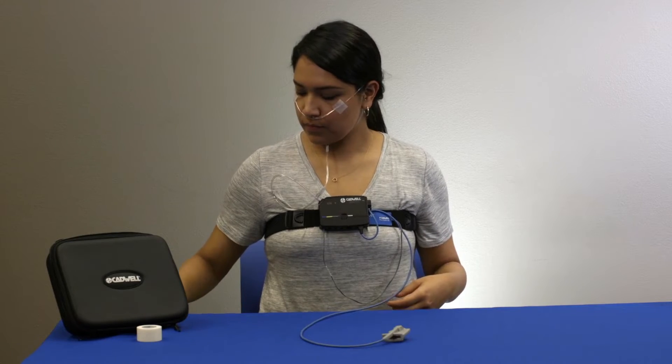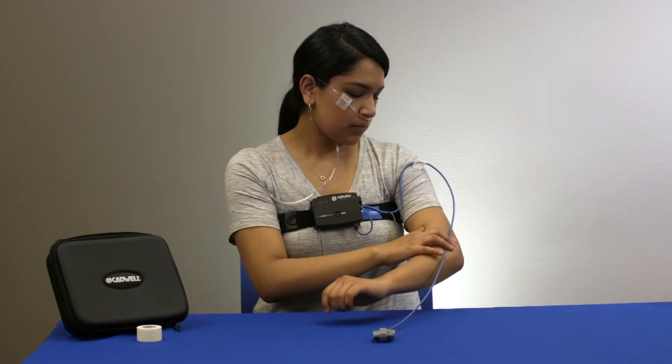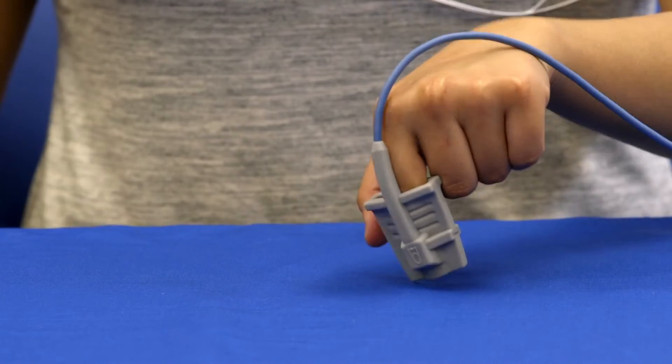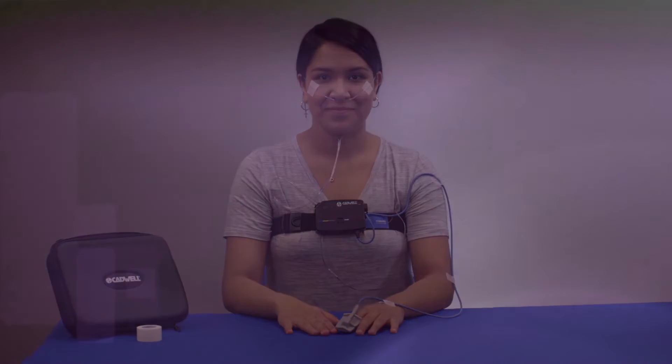If the cable hangs loosely, tape the oximeter cable to your shoulder and elbow. If there is no slack, tape it just to your hand. Close your hand into a fist, then tape the cable to the back of your hand. Do not wrap tape around your finger as this will restrict blood flow and reduce signal quality.